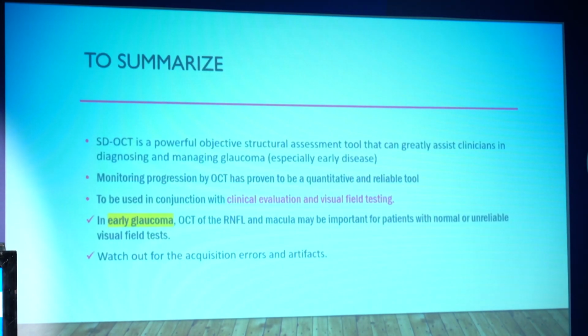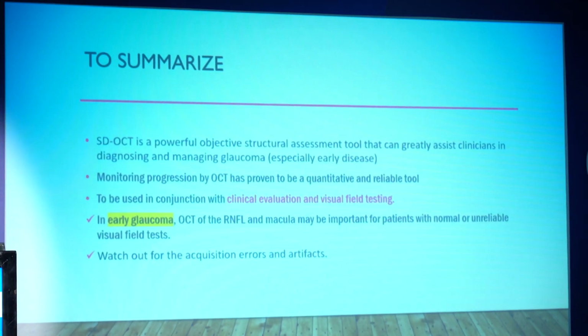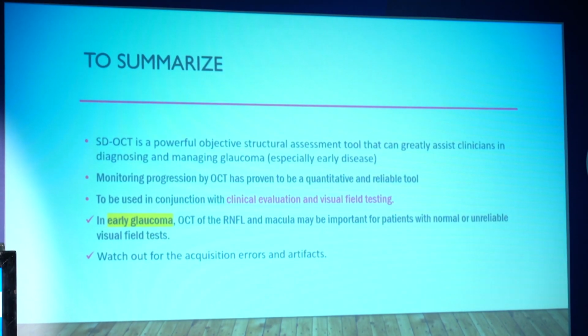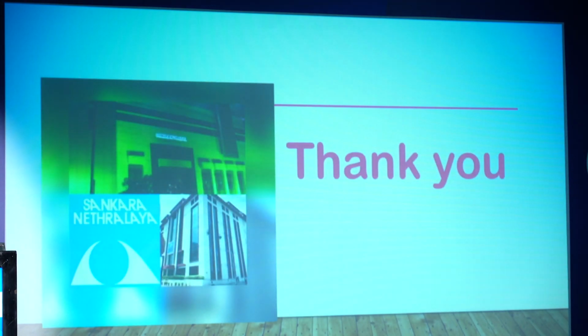To summarize, OCT is a powerful objective structural assessment tool that can greatly assist clinicians in diagnosing and managing glaucoma, and monitoring progression by OCT is also a good quantitative and reliable tool. We should always use it with the clinical evaluation and visual field testing. In early glaucoma, OCT of RNFL and macula is important, and we should always watch out for acquisition errors and artifacts. Thank you for your kind attention.